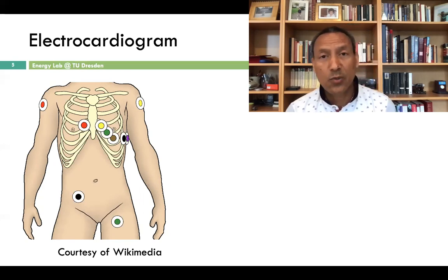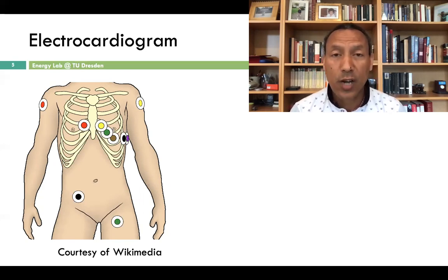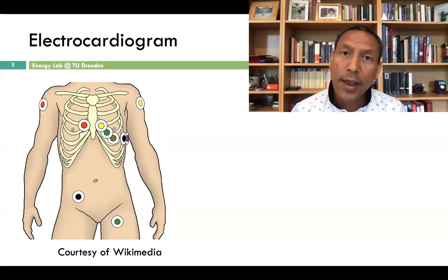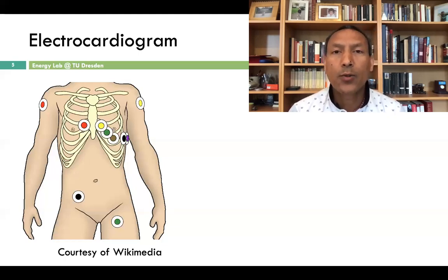So scientists today use wireless electrocardiograms. They are developing wireless electrocardiogram, and my team is one of these people in this effort, so that we can attach wireless electrocardiograms and let people freely move and carry out their everyday activities. While they do so, we observe the electrical activities of the heart and see whether the heart is exerting properly.